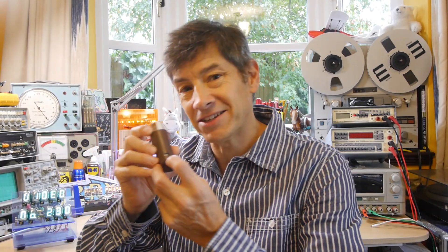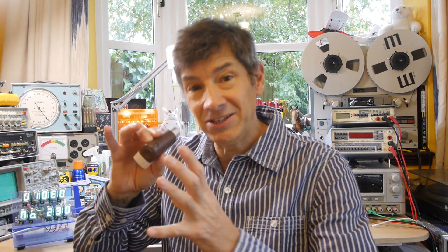I'd like you to see how this counter works because it's a very clever little system built into the bottom of these and it uses a really interesting arrangement of gears.